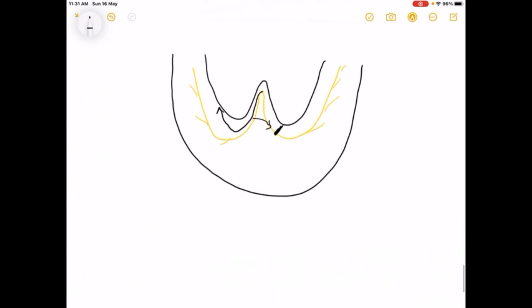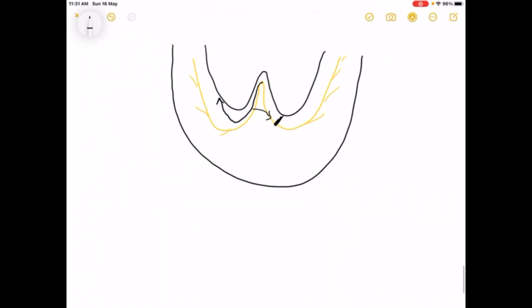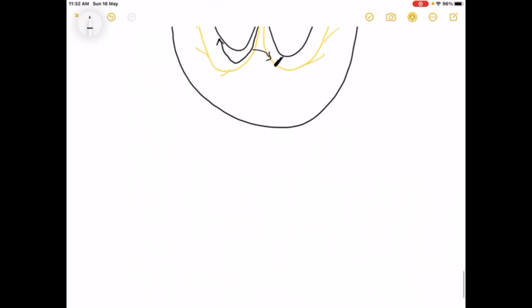Normally, both ventricles are activated by their own bundle branches, and there is very minimal delay in the activation of both. So the QRS complexes of right and left are superimposed on each other on the ECG and cannot be detected separately. Whereas in this condition, since the right is activated first, the right itself has to activate the blocked side. So this delay shows up on the ECG.